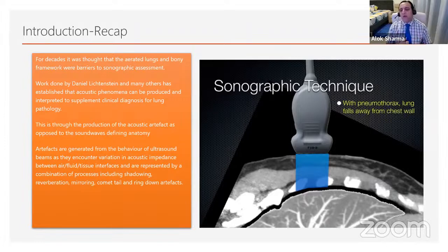I would argue that for all ultrasound, echocardiography and brain ultrasound, the concept is you describe exactly what you can see. Once you describe what you can see, you then make an interpretation of that description, based on clinical correlation, of what it might represent. And you write that clinical impression into a conclusion, which may or may not alter your management.